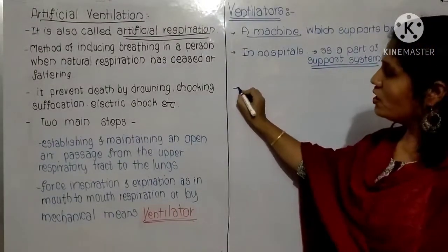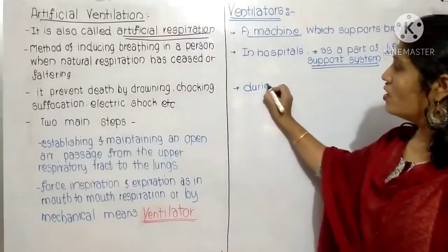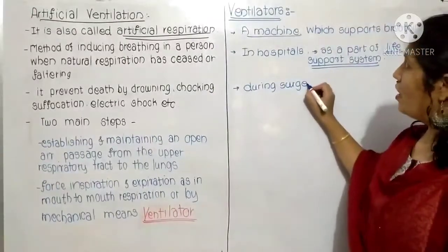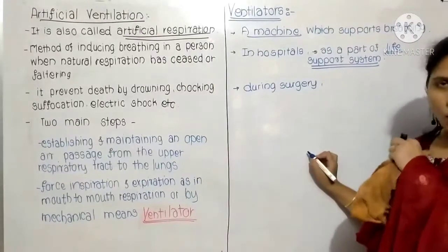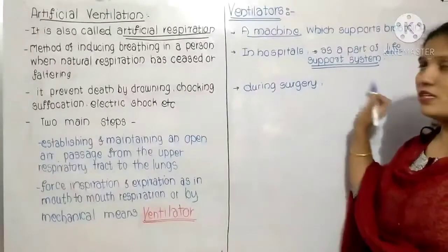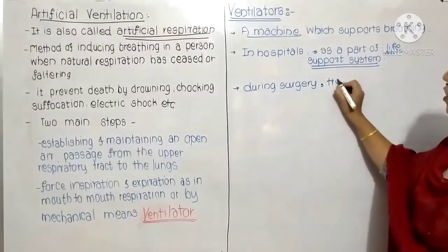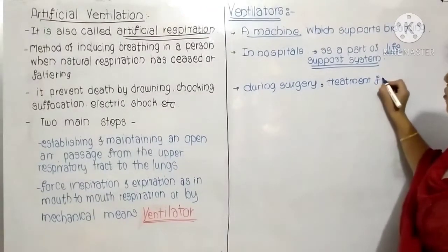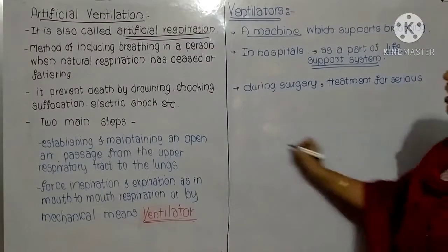In hospitals it is used during surgery, any type of surgery, and also whenever a woman is giving birth to a child, during parturition. It is used during surgery or treatment, for treatment of serious lung diseases.